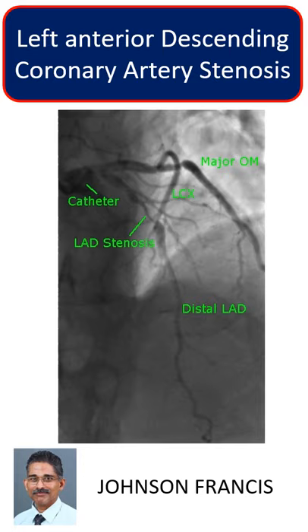The obtuse marginal is a good-sized vessel with a proximal discrete stenosis. The left circumflex, beyond the origin of the major OM, is a small vessel.